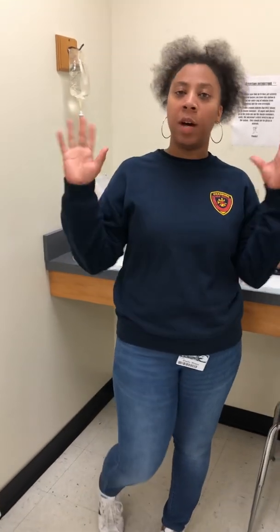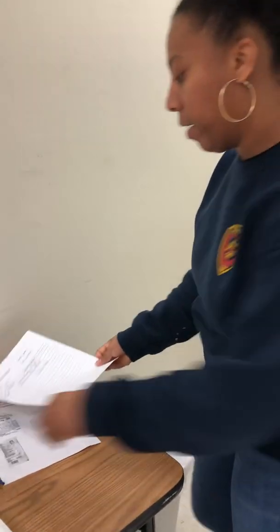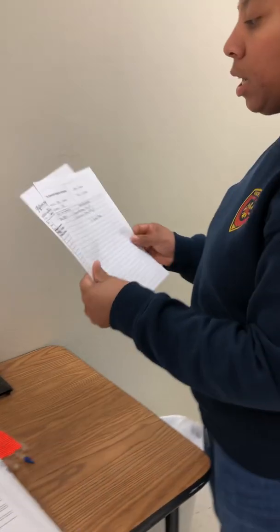Ready? Okay. So I'm about to give an IV piggyback. And first thing I want to do is make sure my physician orders and my MARA matches up. So I have my physician order and my MARA.